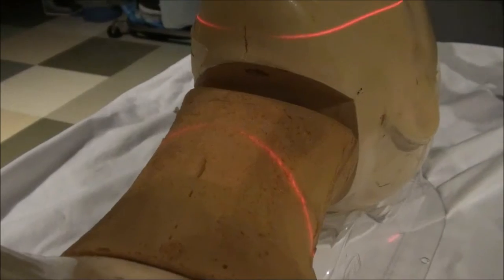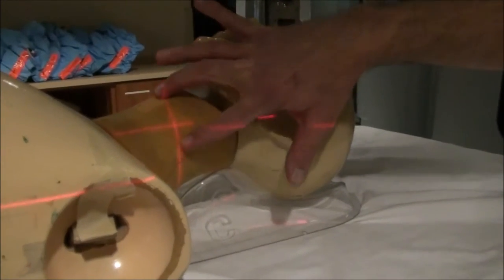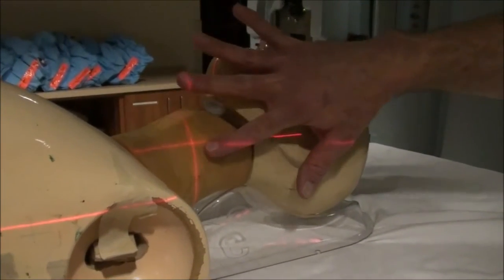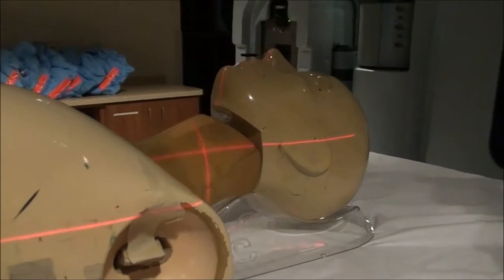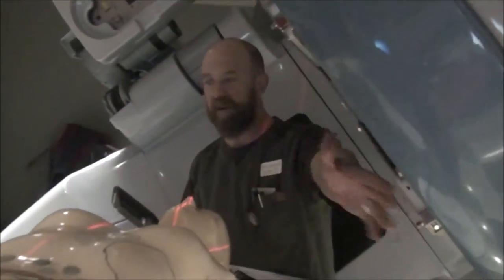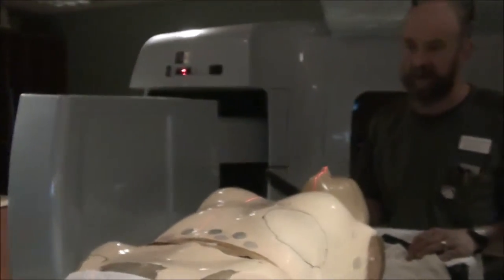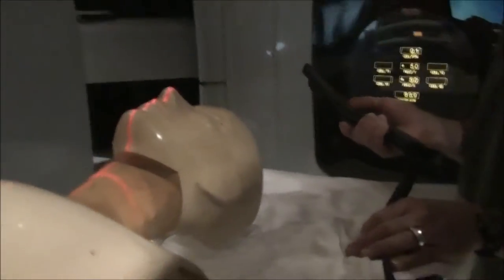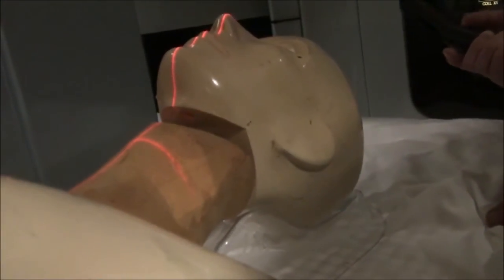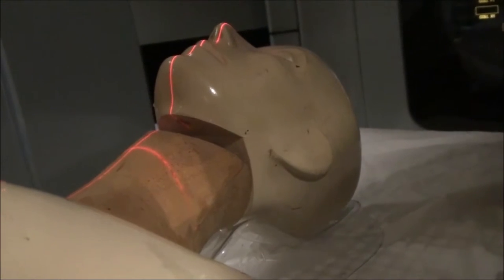I'm then going to raise the table up and go to what I expect would be midline between the anterior flesh and what is probably the vertebral bodies. Then I'm just going to rotate over to my lateral. You don't want to run into your patient with your gantry and you don't want to run the image intensifier into the table. Generally you'll be at the foot of the table. You don't want to hurt your patient and you don't want to ruin the equipment.